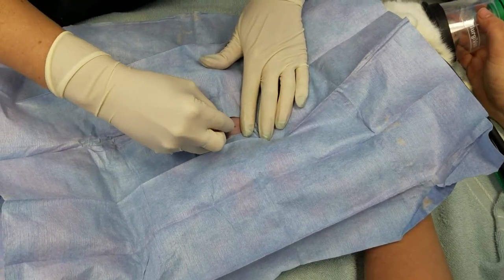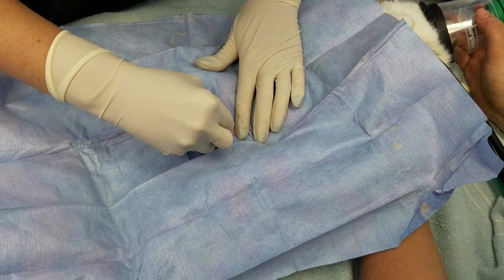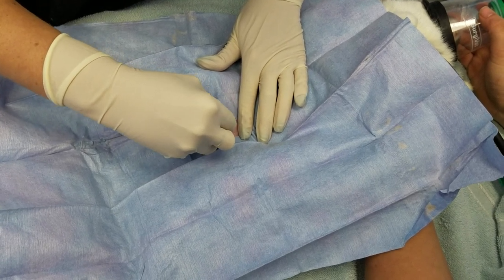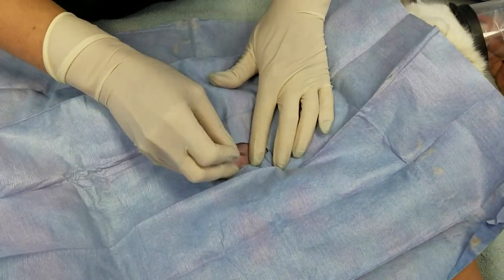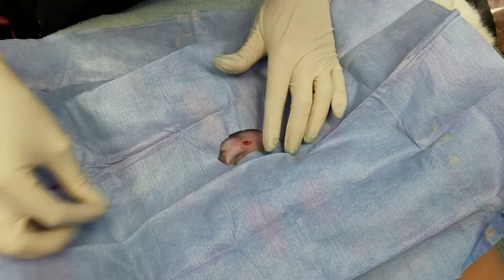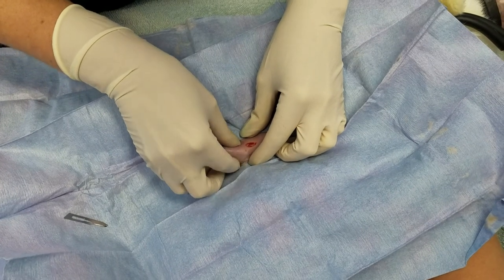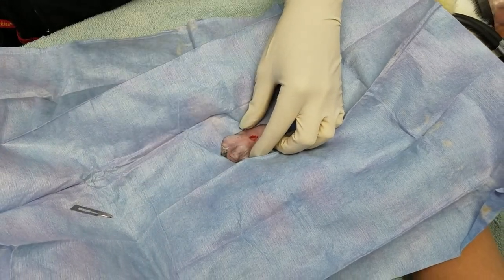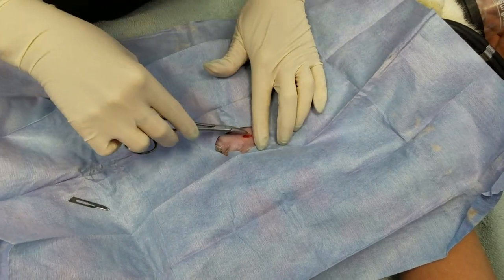So we're gonna make our pre-scrotal incision. And their testicles tend to be very mobile. So they like to go up into their abdomen.